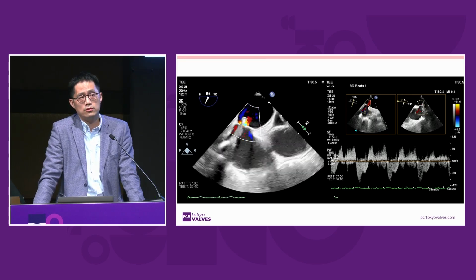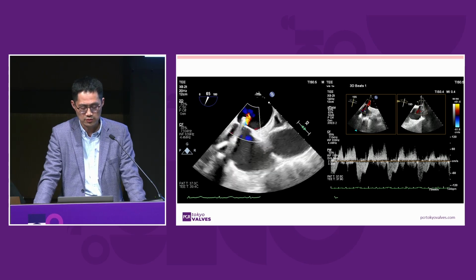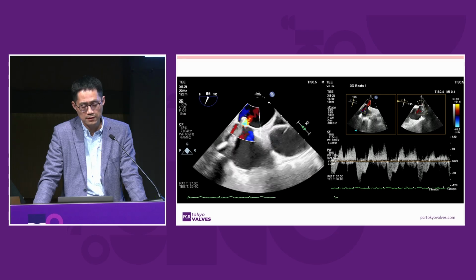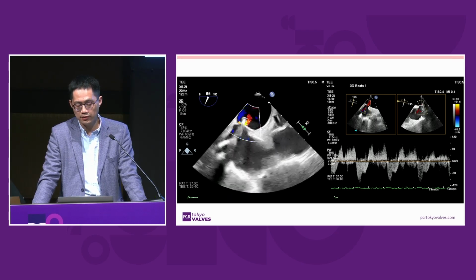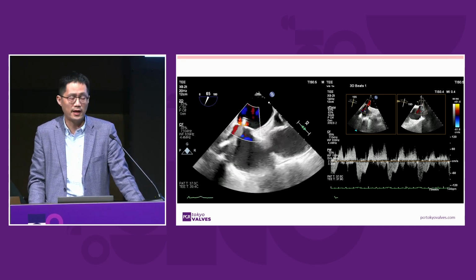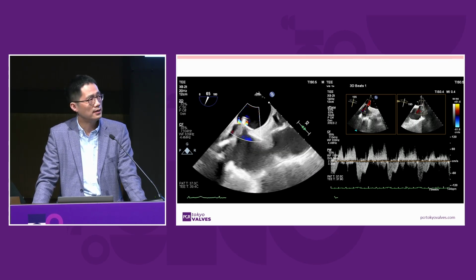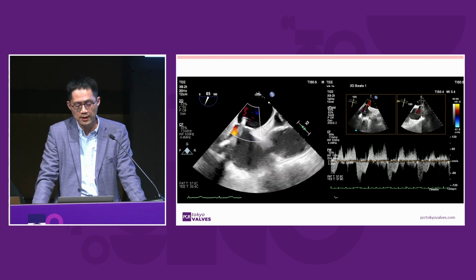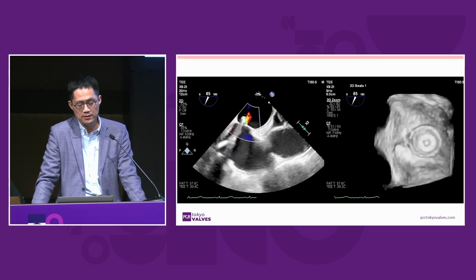Given that before the procedure we already knew that the patient had severely elevated right atrium pressure, even before we crossed with the catheter we had already seen significant bidirectional shunt. After we placed the system on the right-hand side, we could see that the patient actually had bidirectional shunt, more from right to left, and therefore the patient had desaturation. We kept observing for 10 minutes, but the patient still had desaturation. So we went for direct occlusion of the iatrogenic atrial septal defect.